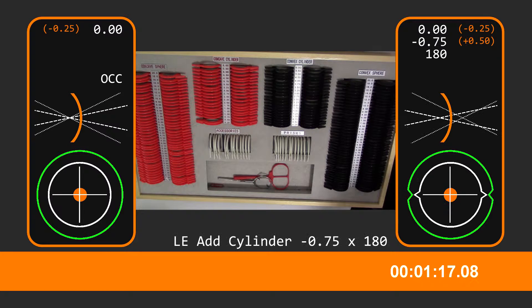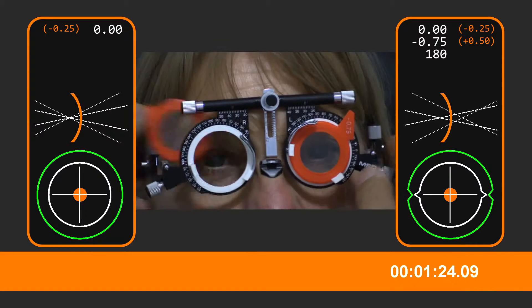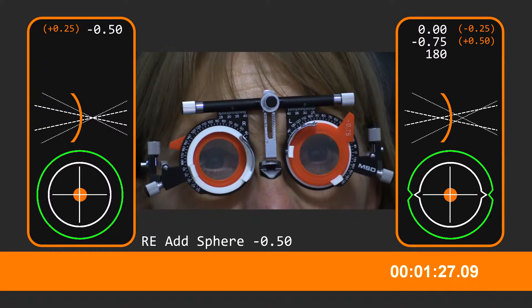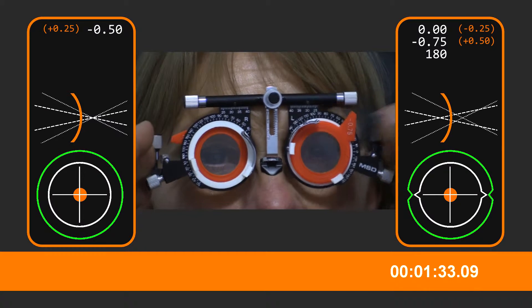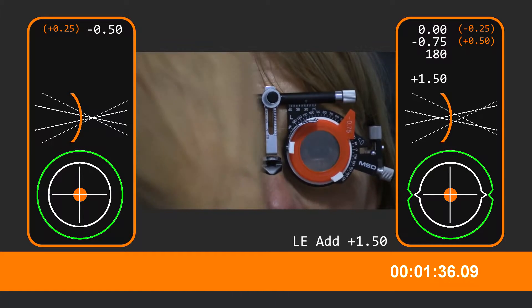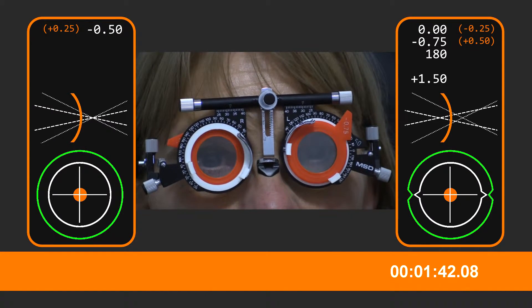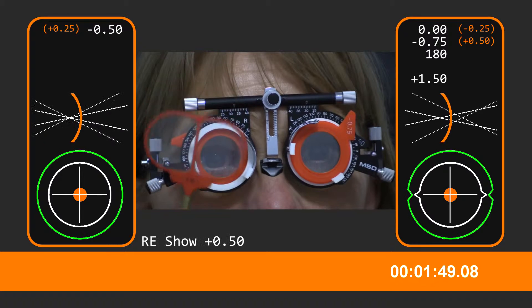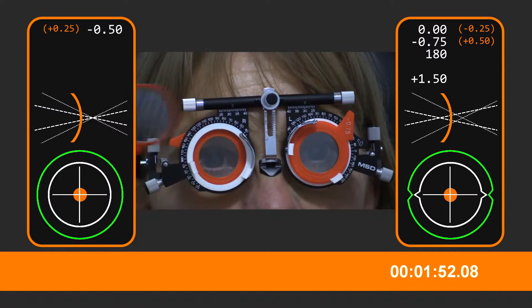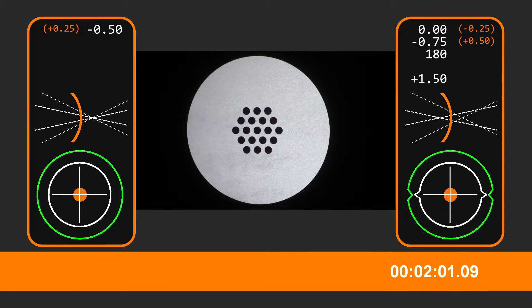I just thought, oh yeah, a nice easy start. It's like a miracle! Is that a bit blurry? Yes, very blurry. Now we're going to work on the right eye — I want you to keep both eyes open. Can you see the bottom line there, the HCP line? If you look at those letters, are they clearer with this one or clearer with that one? Without. What about this one? Without.